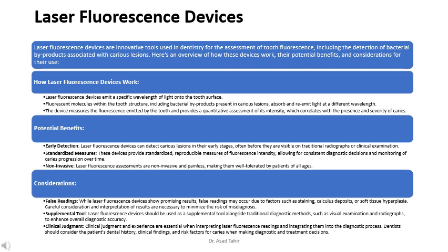Laser fluorescence devices. Laser fluorescence devices are innovative tools used in dentistry for the assessment of tooth fluorescence, including the detection of bacterial byproducts associated with carious lesions. Here's an overview of how these devices work, their potential benefits, and considerations for their use.